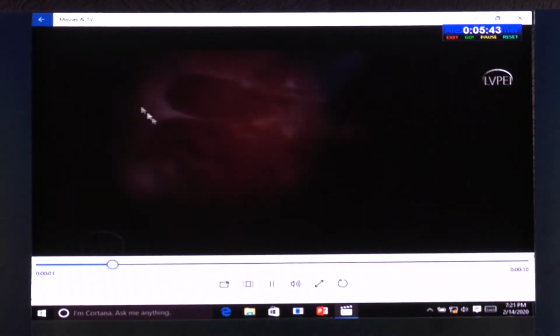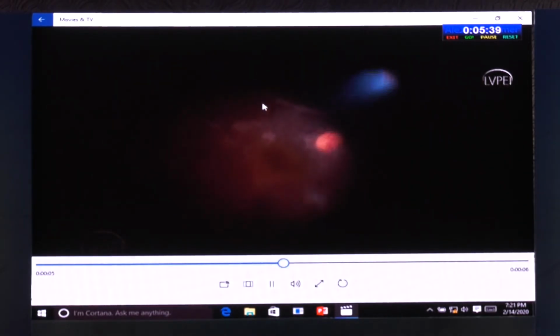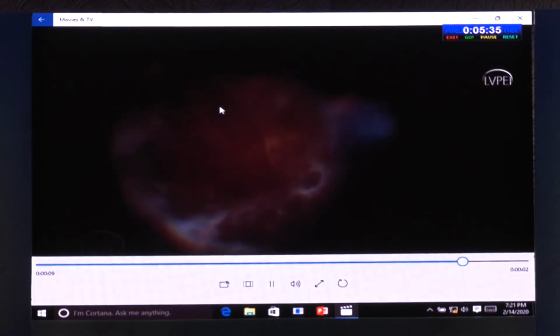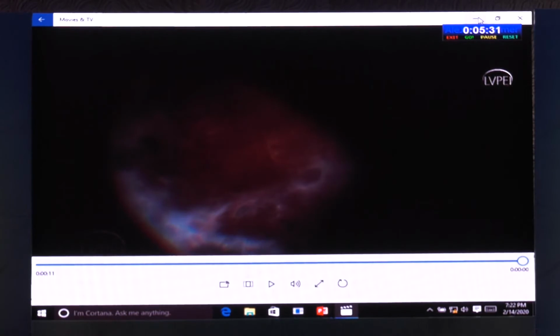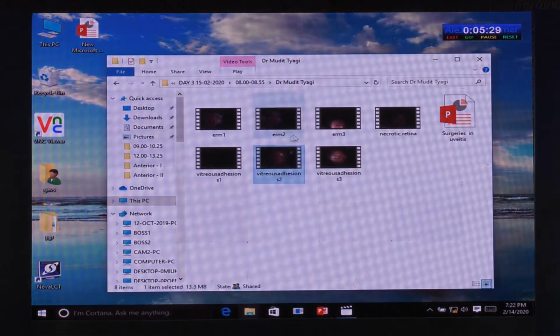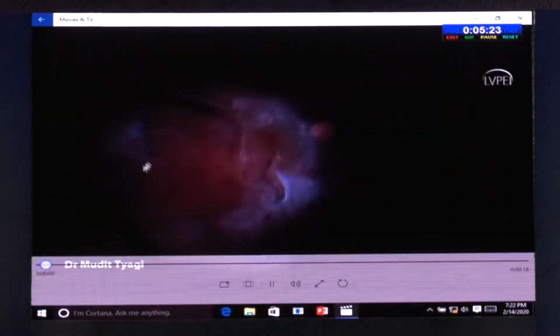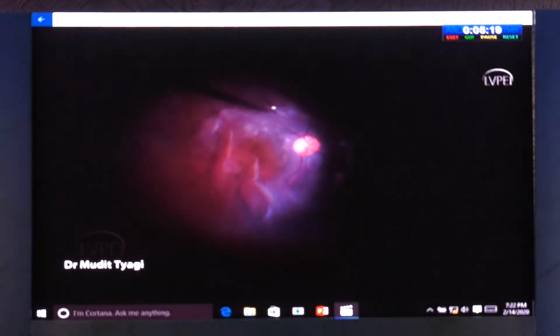If you look at it, these eyes have extensively thickened vitreous adhesions in the periphery, and these vitreous adhesions need to be tackled. Somehow the characteristics of vitreous in eyes with uveitis are much different from what you see in a routine eye. This vitreous is much thicker, and there are a lot of opacities. It probably has to do with more interleukin expression. The ERMs are also extremely thickly adherent, and if you're not very careful, you'll end up causing a break. So you have to be very careful in removing these ERMs.